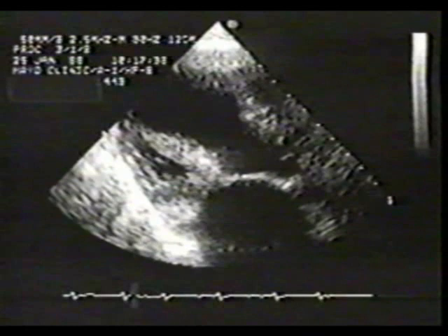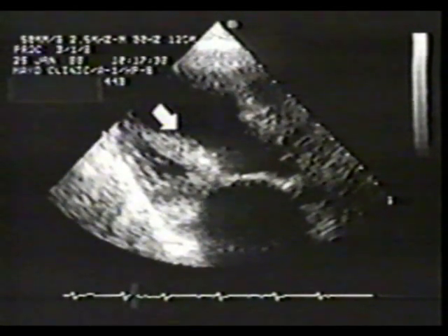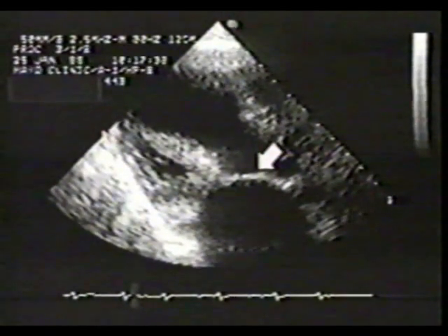From the preceding long axis view, it would have seemed likely that we could simply rotate to short axis and planimeter the orifice and thereby accurately assess the degree of stenosis. However, this is the same patient imaged with the transducer positioned near the apex and tilted to inspect the subvalvular apparatus. This is the left atrium, and this is the anterior mitral leaflet.